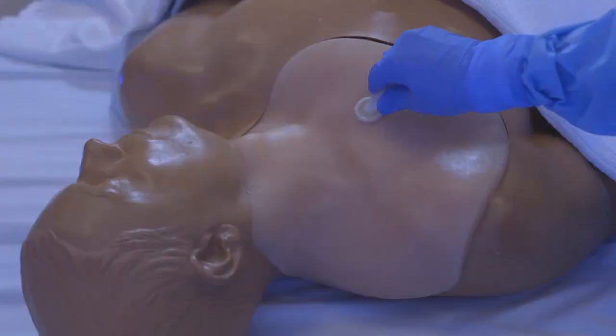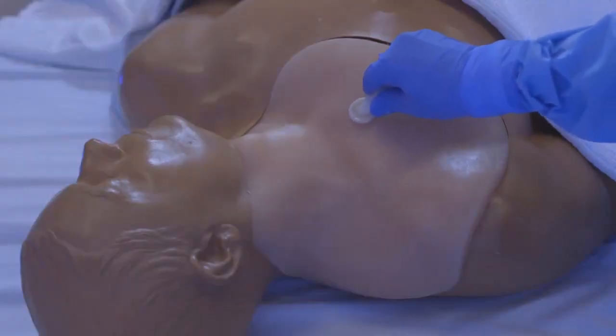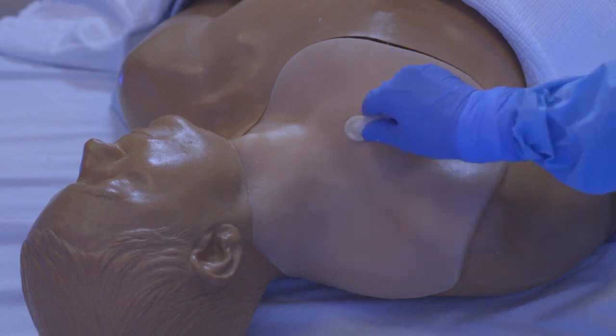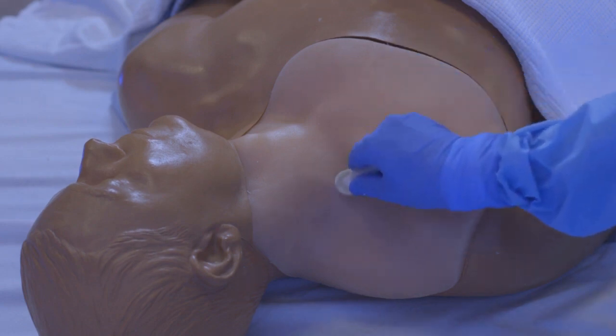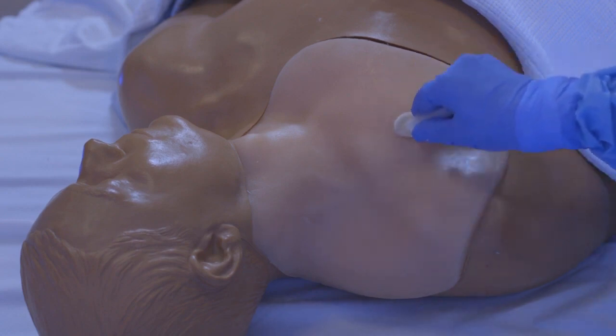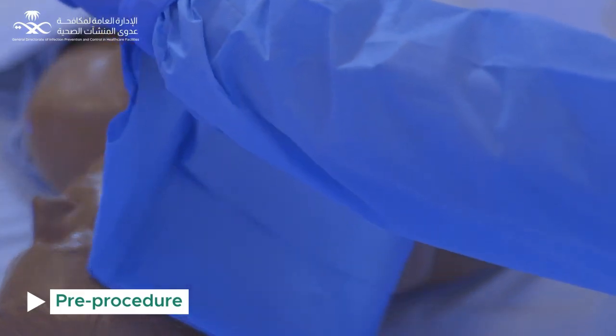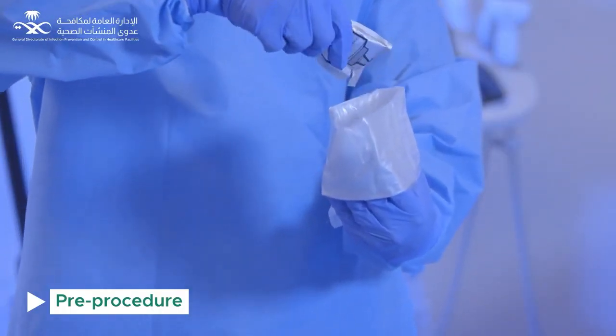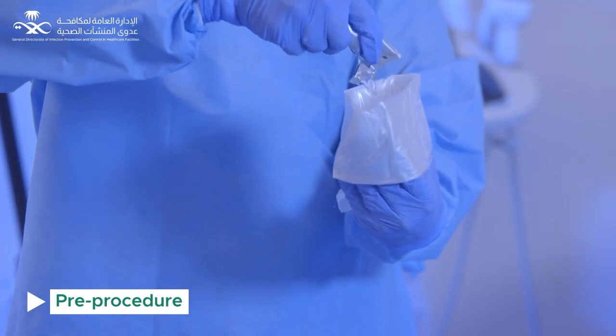Skin preparation. Do back and forth motion using 2% chlorhexidine gluconate with 70% isopropyl alcohol stick for at least 30 seconds. Allow it to dry completely before puncturing site. Drape patient from head to toe using sterile technique. Apply sterile cover to the ultrasound probe with sterile gel to confirm anatomy.